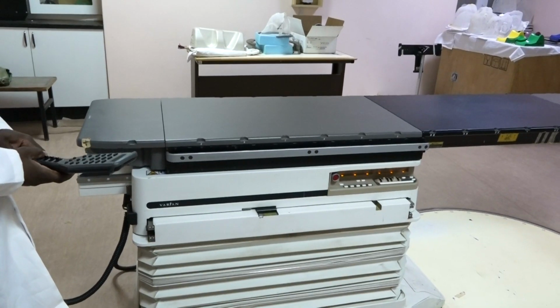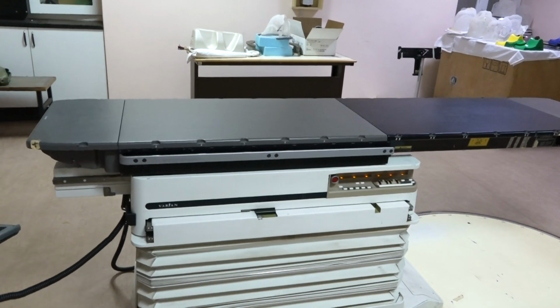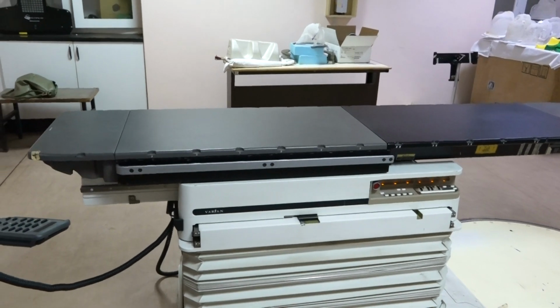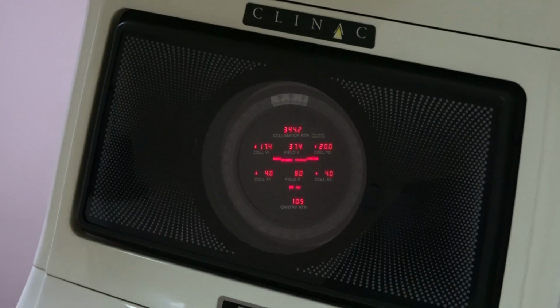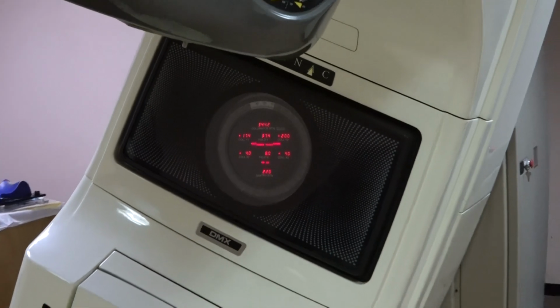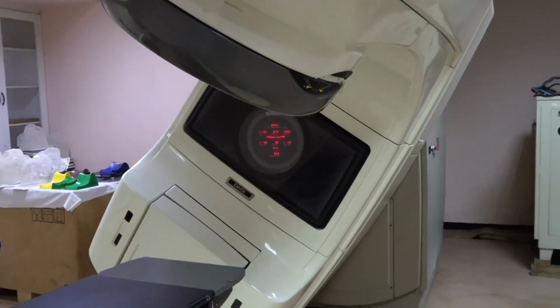So these machines are just there to scan out what you have and identify, and then you are given treatment afterwards, or they also administer the dosage, as you said, of treatment and giving the treatment as well? The linear accelerators are used to treat.